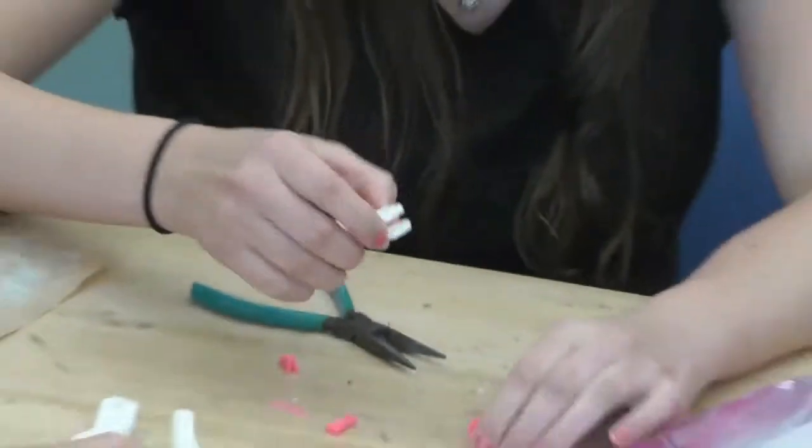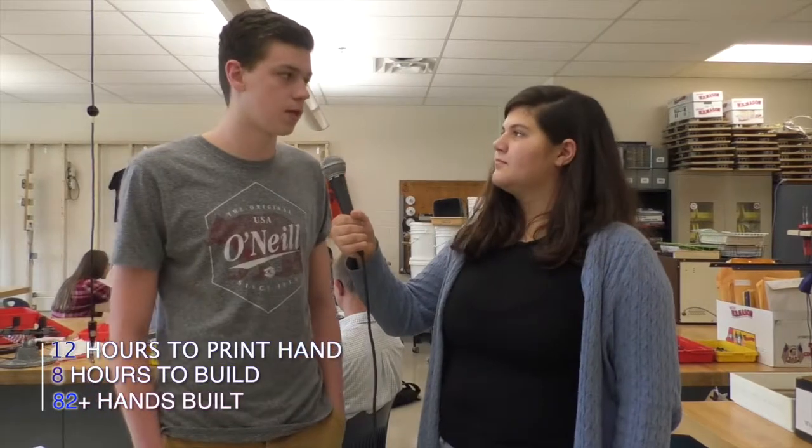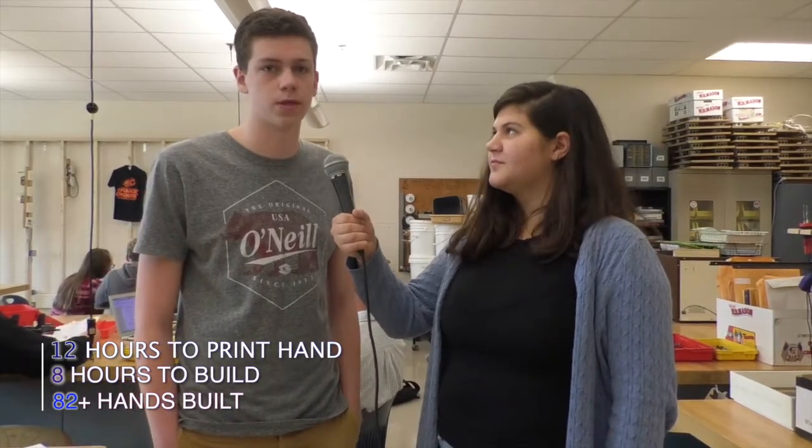How long does it take to put together the hands? Currently it takes around 12 hours to print out a hand and then it can take anywhere from 8 to 12 hours to assemble a hand.